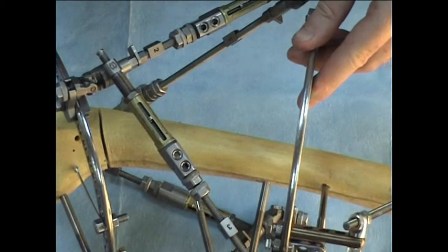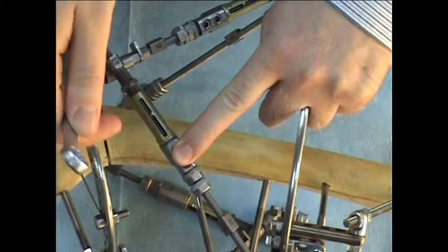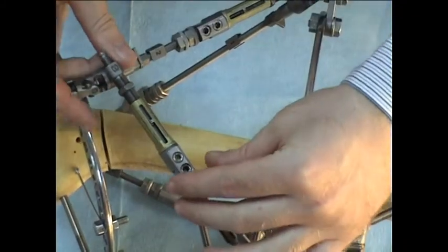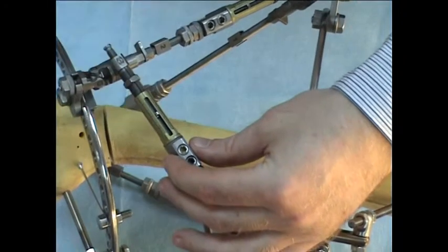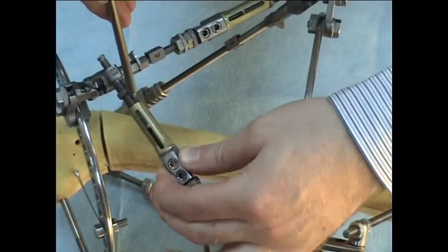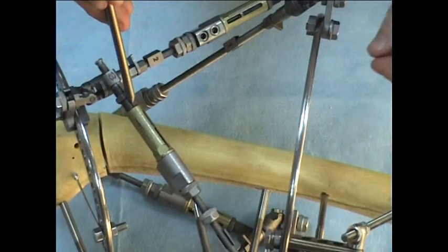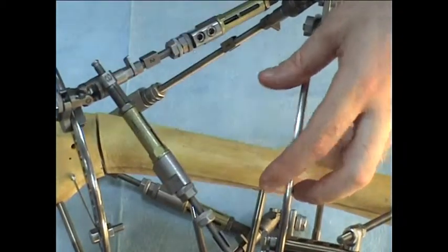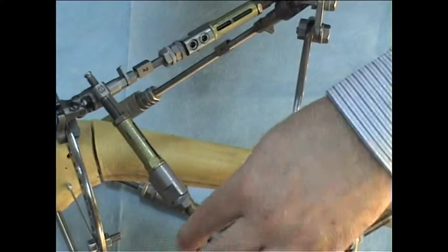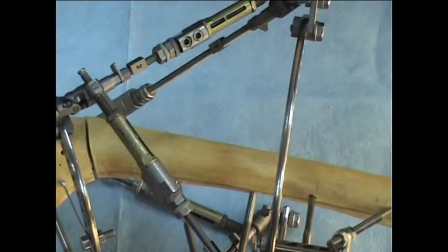The next example, we have a task to make the strut -3, so we have to shorten it by 0.75 millimeters. We untighten the lock nuts, and then we turn the yellow cylinder for 3 quarters, so 3 times from one black line to another relative to the bold black line. 1, 2 and 3. We have made shortening of the strut by 0.75 millimeters or by -3 as is in the patient's schedule. Then we tighten the lock nuts.